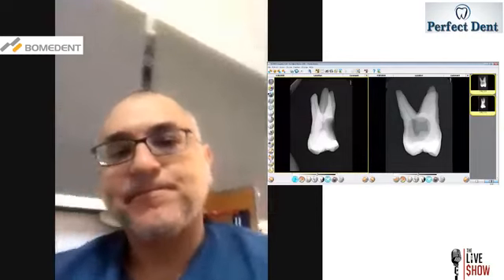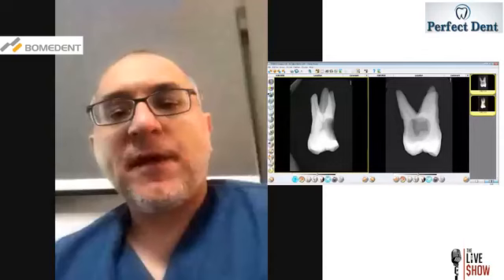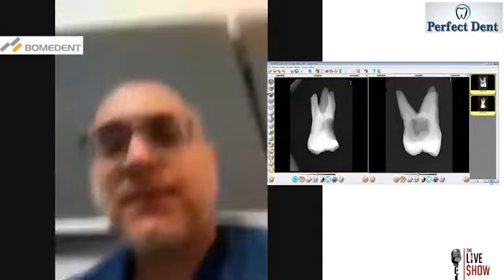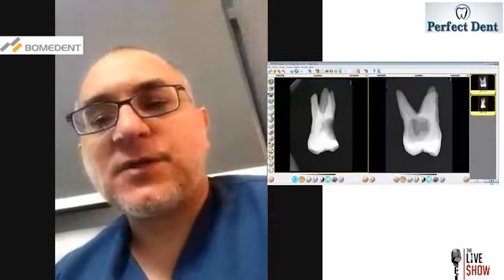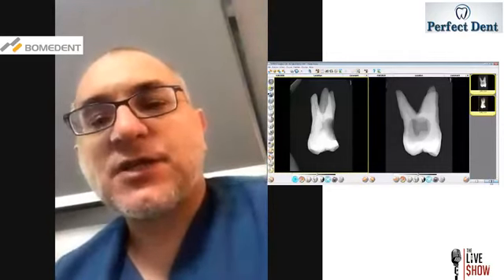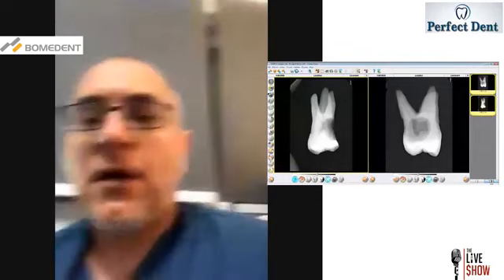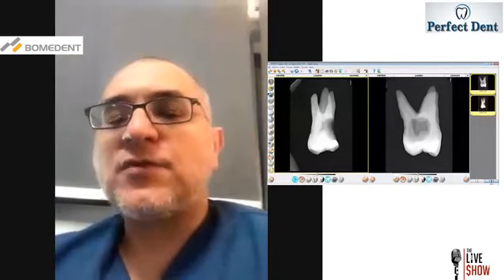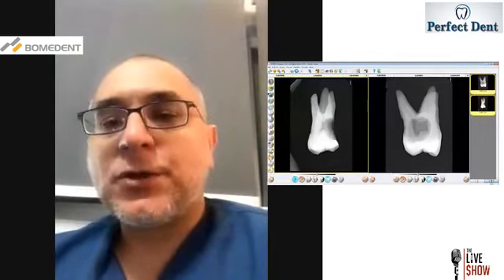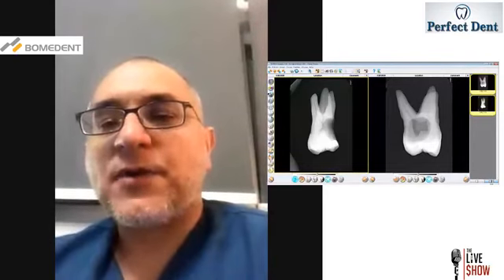No questions? Okay, so the next part of the session will involve me preparing the canals. The canals will be prepared using a dual instrument system to a size 25/06. The first step that I did before we had the technical issues was coronal pre-flaring, which is an enlargement of the first 3 or 4 millimeters of the canal space using a large tapered instrument.